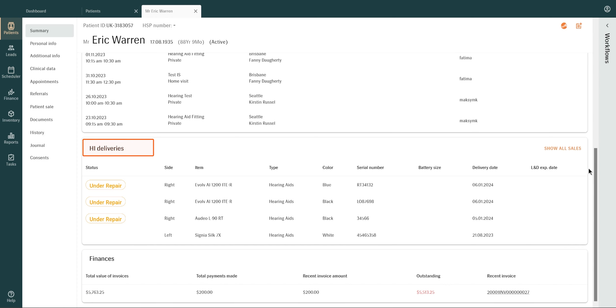Hearing Instrument Deliveries provides information about hearing aid purchases, including details like serial numbers. To view a patient's complete sales history, click on Show All Sales.